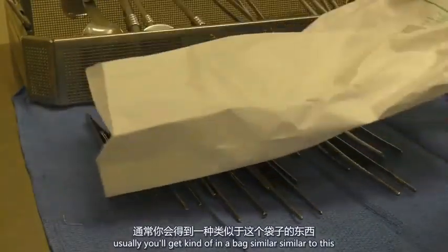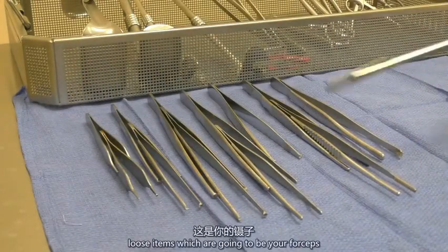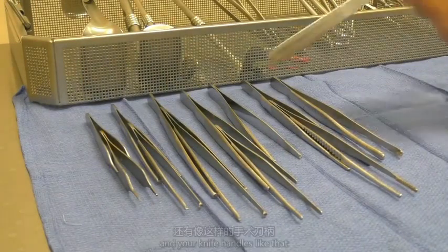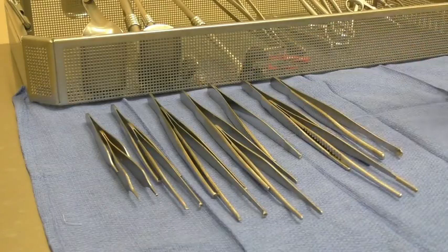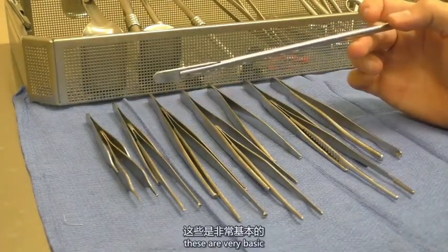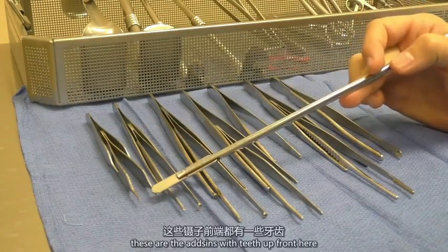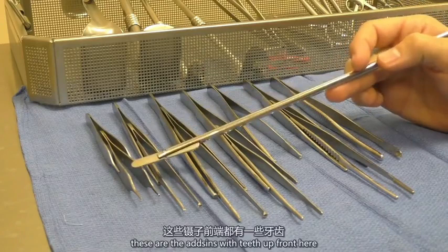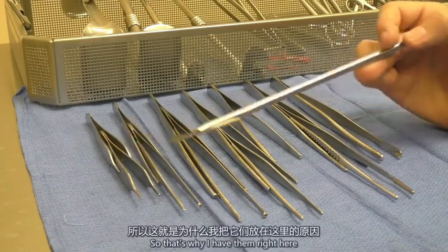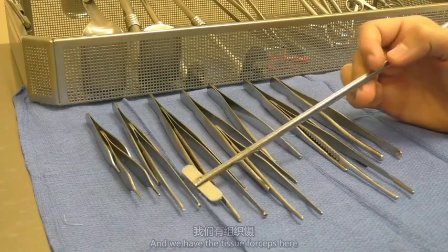Alright, the last part of this tray is everything that you'll get kind of in a bag similar to this. It's basically all of your loose items, which are going to be your forceps and your knife handles like that. Alright, so breaking these forceps down, these are very basic because again this is a minor general tray. These are the Adsons with teeth up front here, obviously used for skin, so that's why I have them right here. And we have the tissue forceps here.